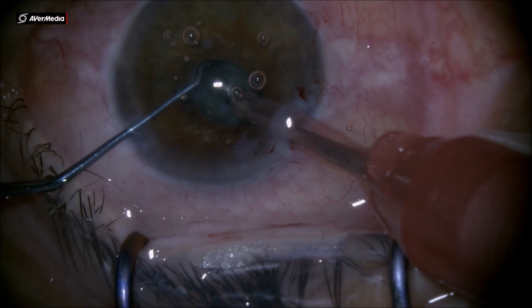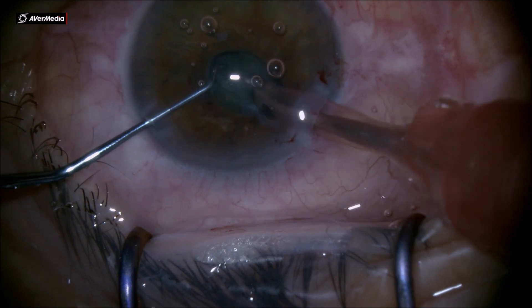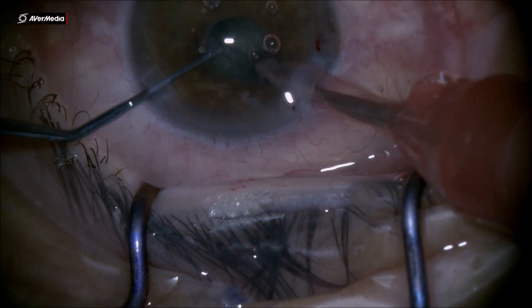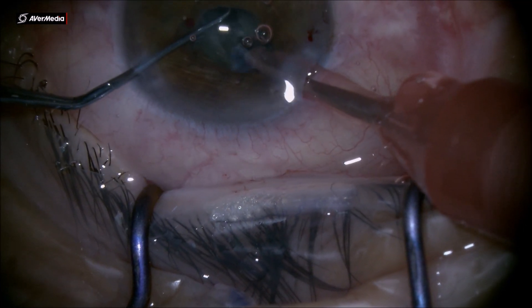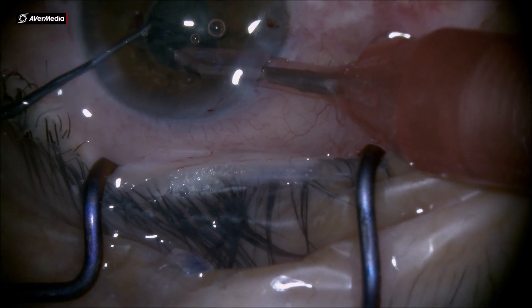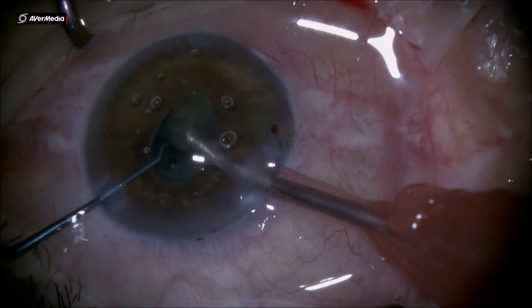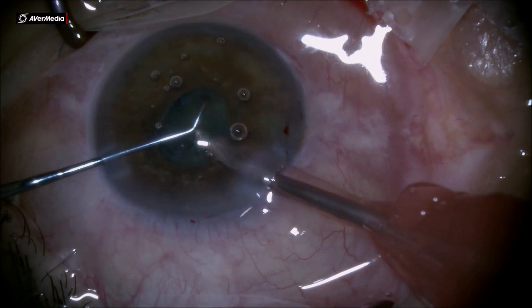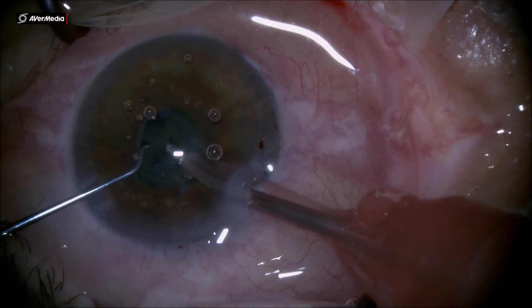Using the Mishev chopper, it's so easy to divide the nucleus into two sections. Having that spatula tip makes a lot of contact with the nucleus, and lateral separation gets very easy. You can see a vertical chop done with the Mishev chopper, and then a lateral chop and horizontal chop. Using this chopper in so many cases — it's so versatile that you can use it for any kind of chop, divide and conquer, stop and chop, or any technique you need.